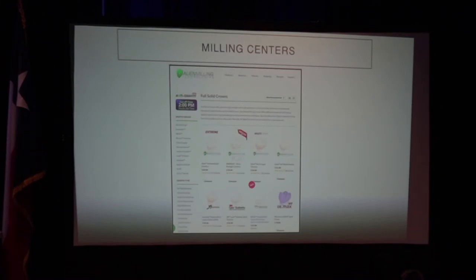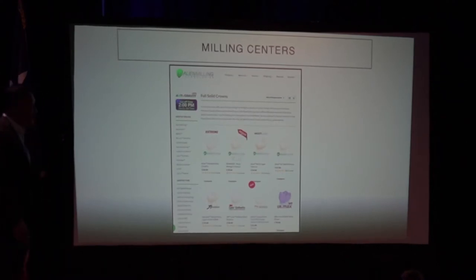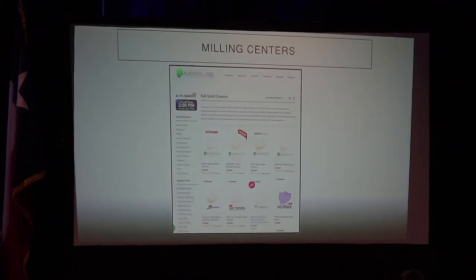But before that, I outsourced, right? Because you're in a digital workflow, the data acquisition, that's why I start off with CAD/CAM. The data acquisition is the intraoral scanner or PVS impression. With the PVS impression, the lab is going to have to digitally scan that, and you can send it to a milling center. This digital milling center is not going to take a PVS impression, but you can get a unit for $29, $28, $22, just based on the zirconia. So you start calculating all these things. Getting into a digital workflow is going to save you a lot of time, and you'll get these crowns back within 4 days. Then I was starting to get some quality control issues, so I decided to buy a mill.